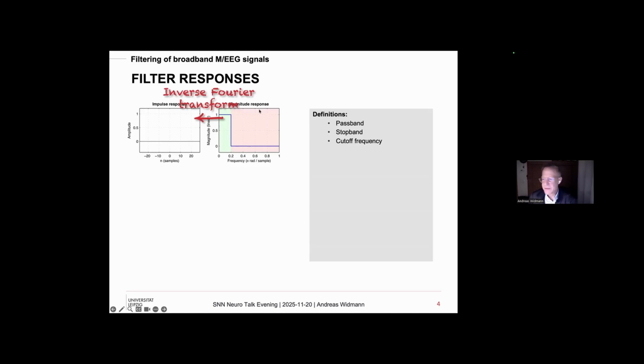And we can do an inverse Fourier transform. This is just math. It's not even complex math. Basically, you can follow that in very simple terms. The inverse Fourier transform gives us a time domain signal. As the filtering in the frequency domain, as we did it before, is typically problematic because the signal is far too long and the FFT would simply take too long, we typically implement the filtering in the time domain. What would be multiplication here is mathematically perfectly identical to convolution here.